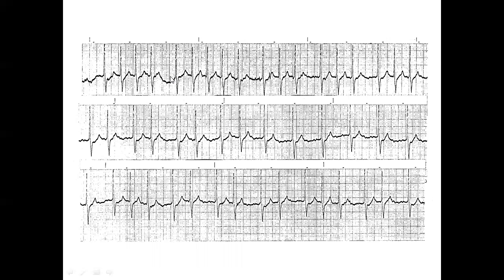So the junctional pacemaker fired here promptly, fired somewhere here, delayed, fired here, further delay, further delay, further delay, then block. So this is an exit block with a junctional tachycardia, rather far advanced state of digitalis intoxication.